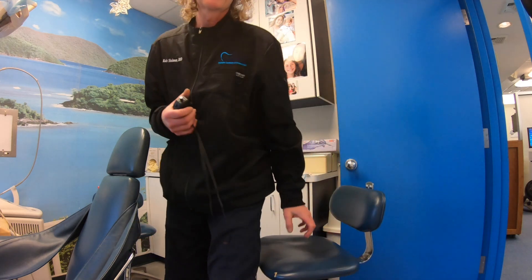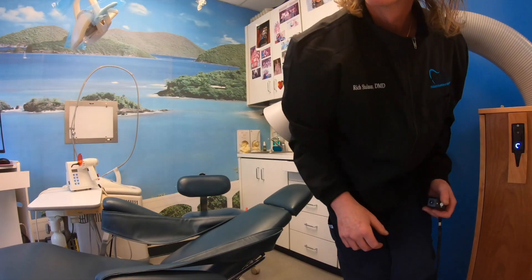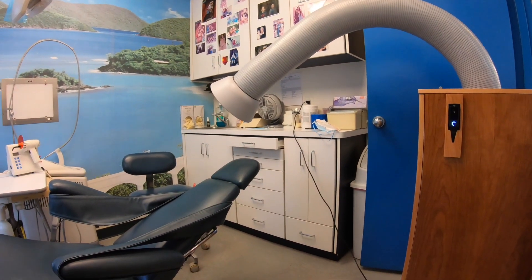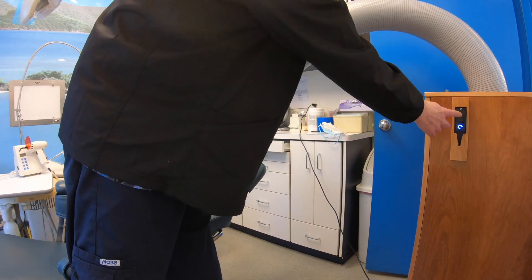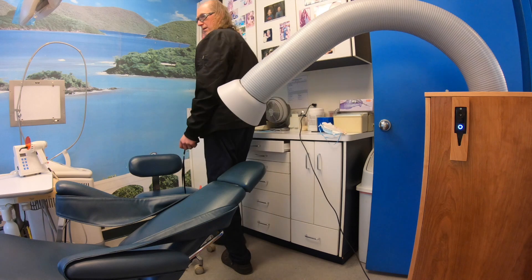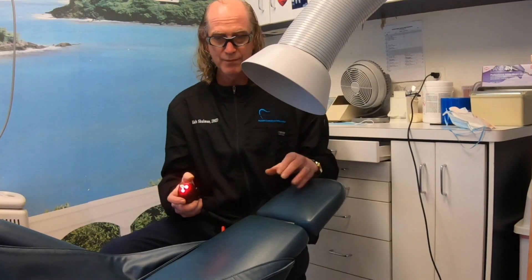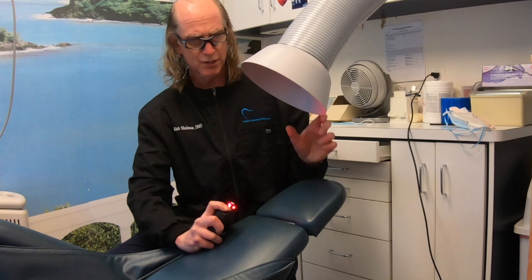Let me bring it in. Let's see how it works over a patient — a fake patient. I'll use a little bit of smoke to see what I can see in the video. I can see it's working. They're working.